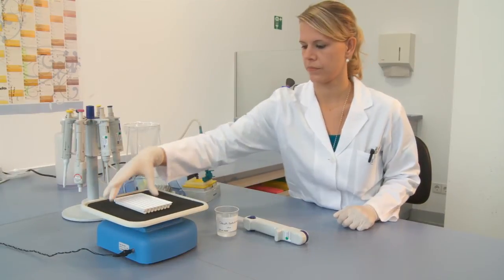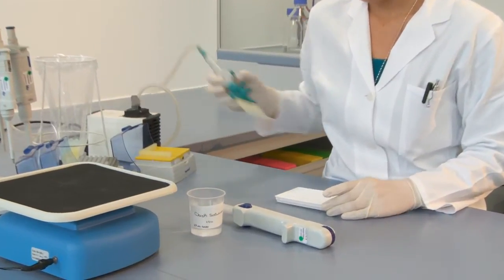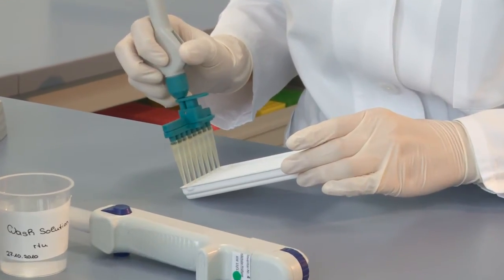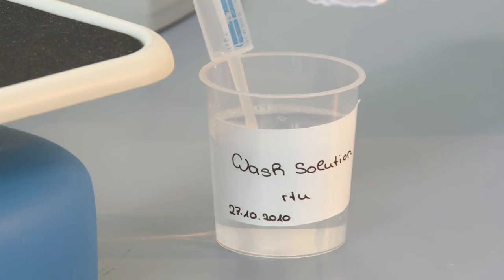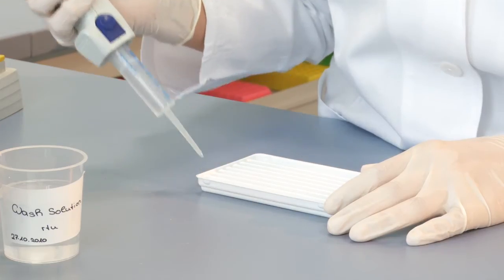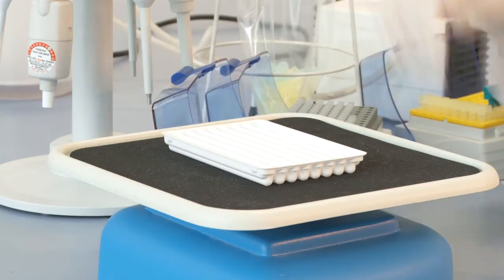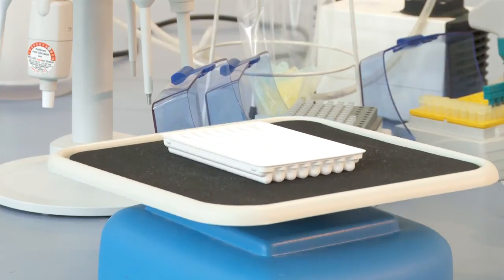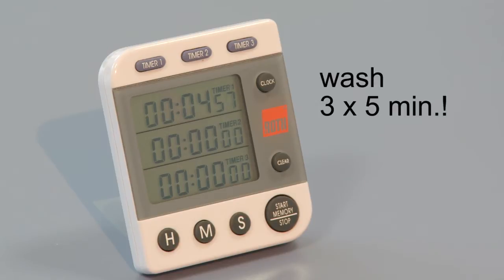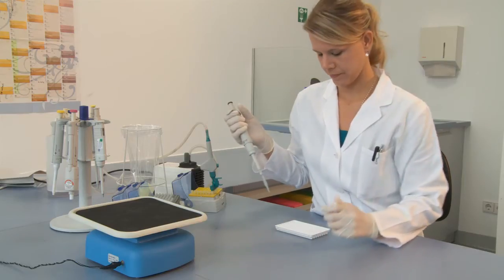After incubation, the serum solutions must be completely removed by decanting or suction. Next, two millilitres of wash buffer are pipetted onto each immunoblot strip. The tray is then rocked for an additional five minutes for washing. The wash buffer must then be removed. This washing process must be repeated two more times in order to remove all non-specifically bound serum components.